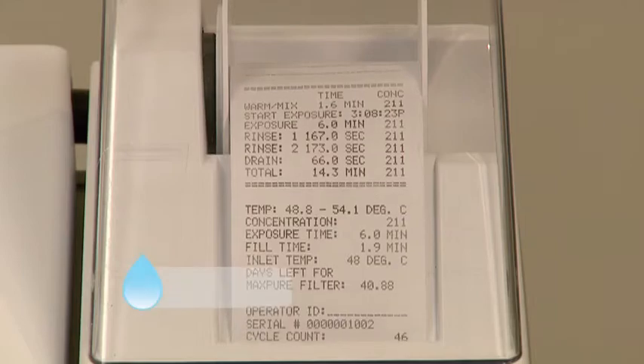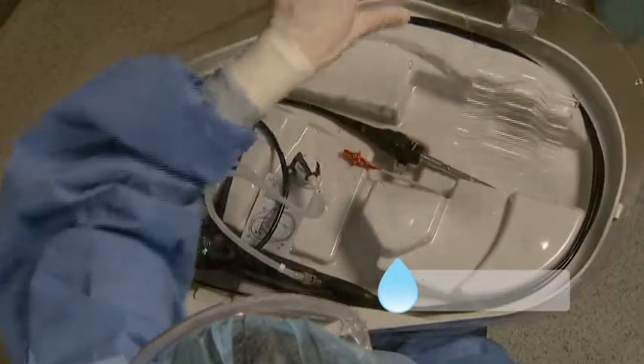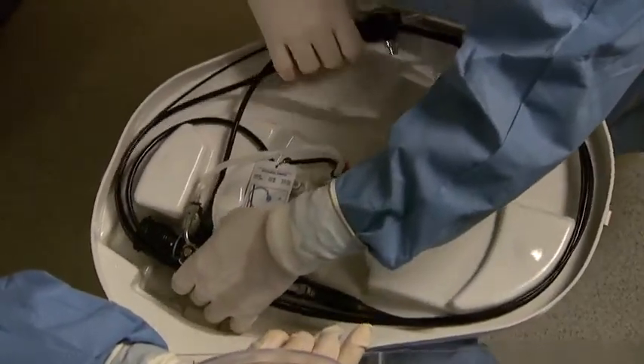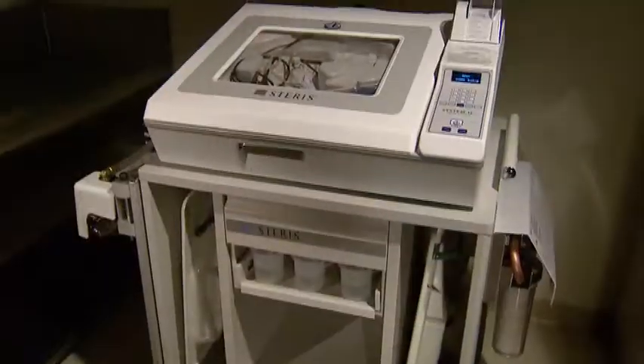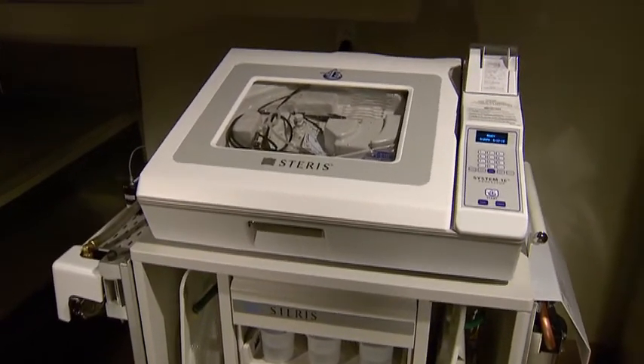A validated system ensuring a consistent process, it delivers excellence in liquid chemical sterilization with a safe and efficacious process for cleaned, immersible, reusable, heat-sensitive critical and semi-critical devices.